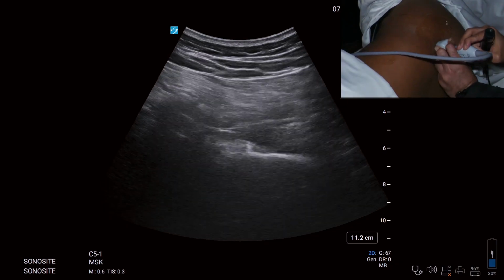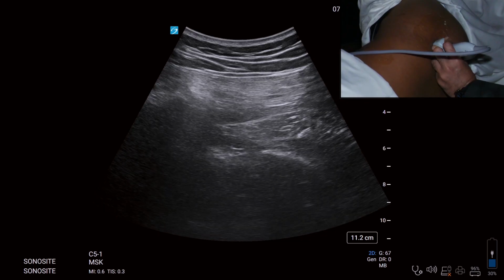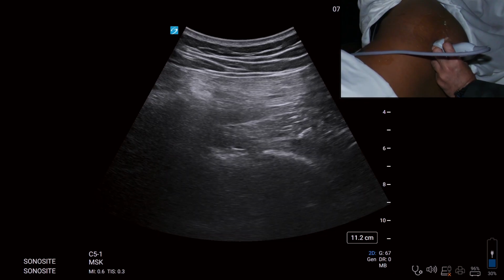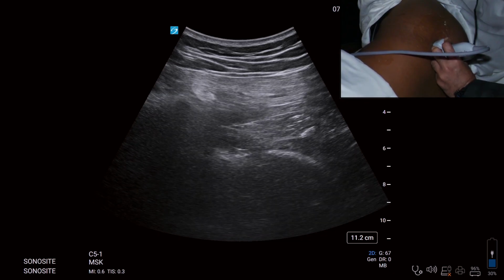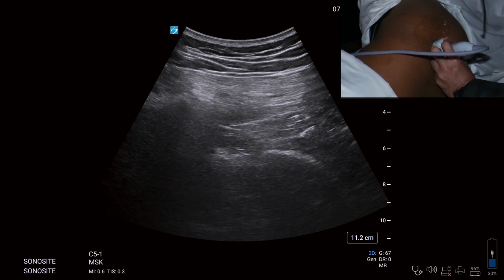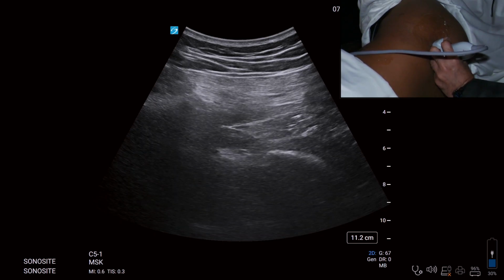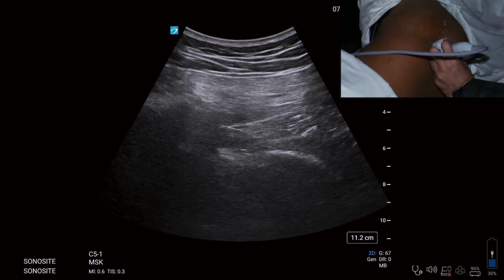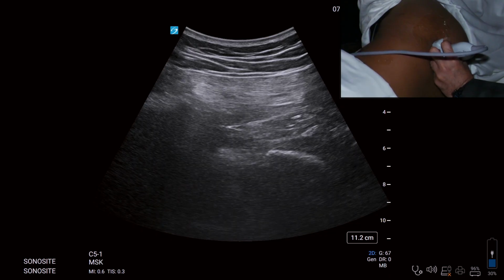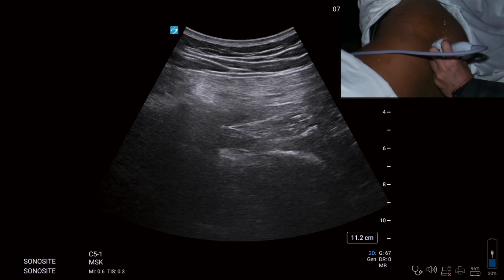So I'm trying my level best. So I think the previous image was much better. Now it has come much more closer to the bone. So for analgesia, what we recommend is do not go close to the sacral plexus. In 2020, Madan Narayan and Venkata Raju stated that all the nerves in the body are situated in musculofascial planes. So a good technique would be, instead of coming close to the plexus, come close to the edge of posterior border of the ischium, deposit 20 mLs, the drug would flood the sacral plexus.